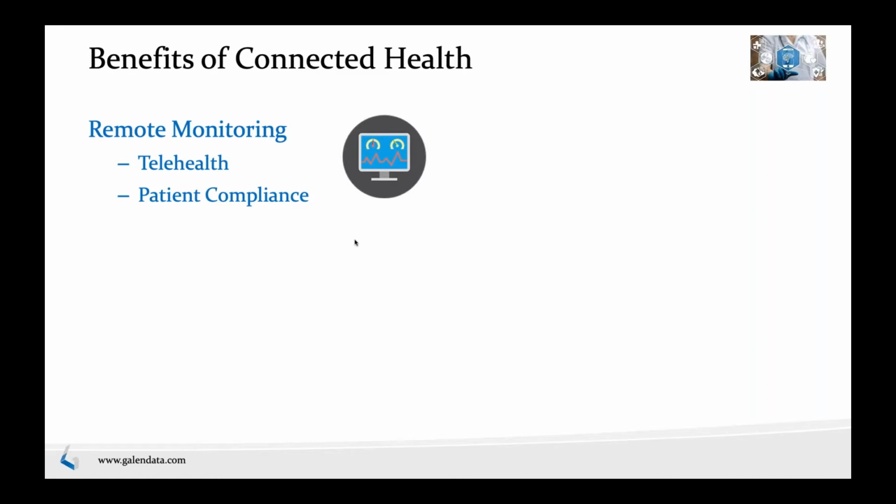The reimbursement happens when that particular patient uses the device a certain amount of time in that week. Tracking and reporting those kinds of metrics at scale, if you do it manually, is very, very costly and prohibitive. So they have no choice but to figure out a way to use cloud connectivity. Also, connectivity allows them to monitor the patient and intervene early if the patient is not using the device as prescribed. So again, you prevent some of the compliance issues there.